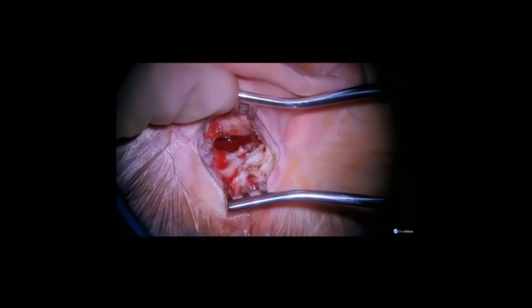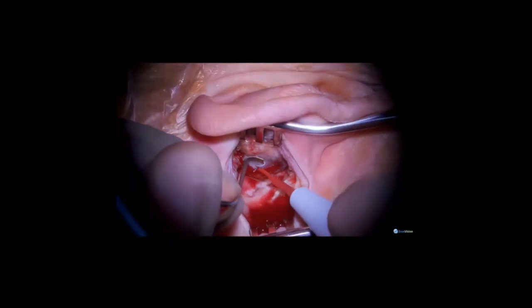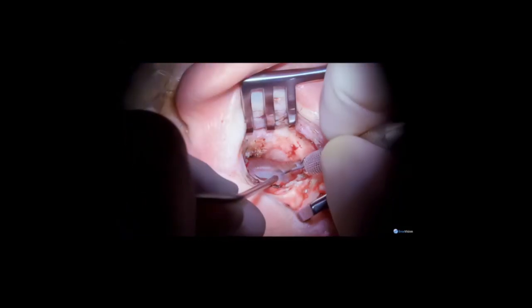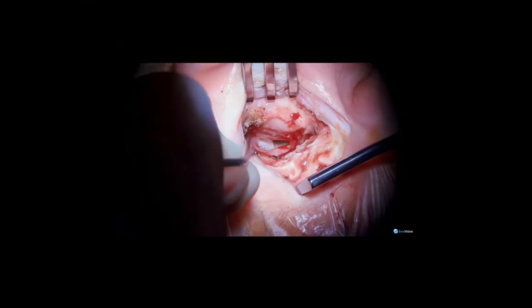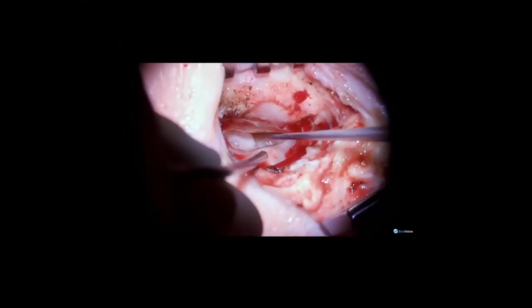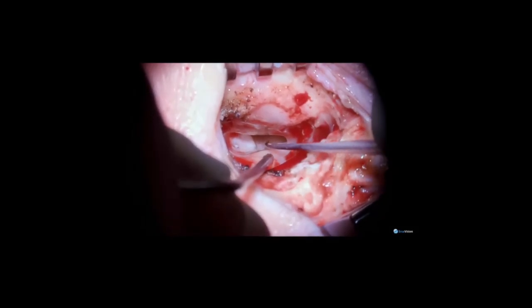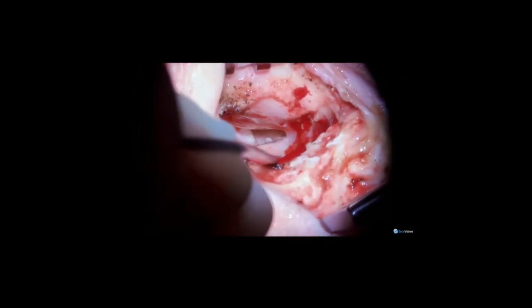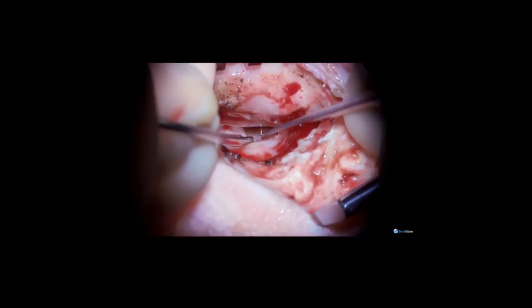I use the upper third of the incision and place a small retractor. I open the mastoid, and during the first stage of the procedure, a silicone sheet has been left in place, which helps support the position of the cartilage and the graft for the new eardrum. Here you can see that there is a movement of the stapes and a good movement of the cartilage graft that is healed nice and flat due to the placement of the silicone.